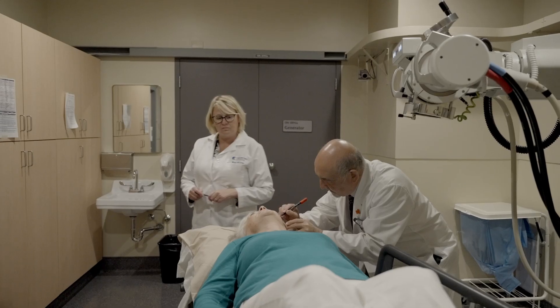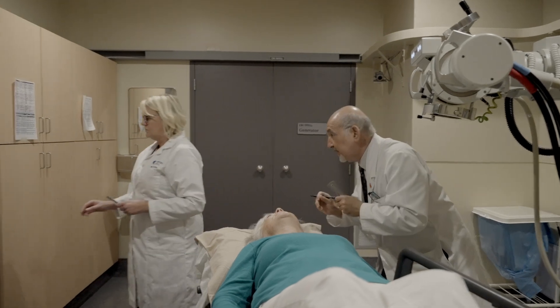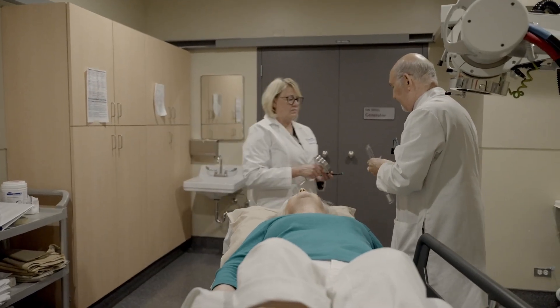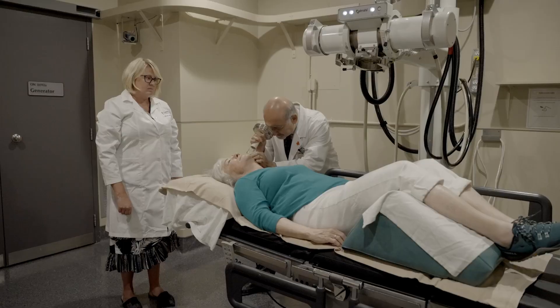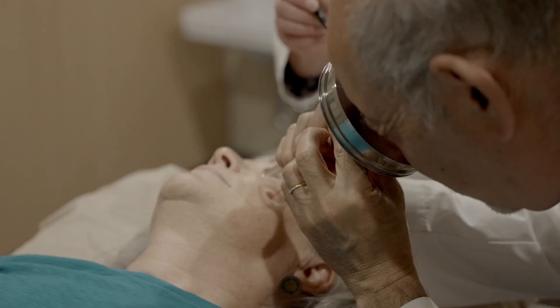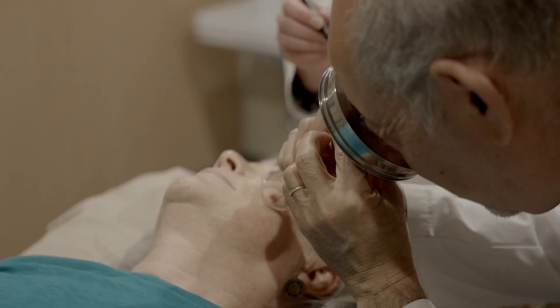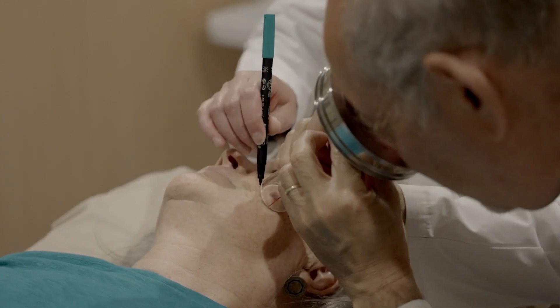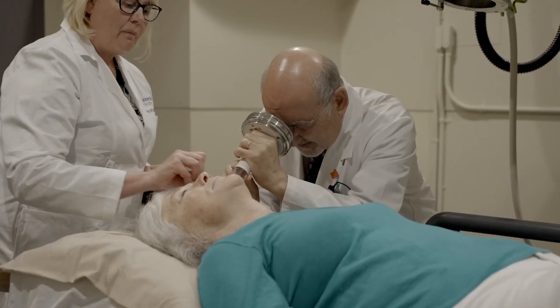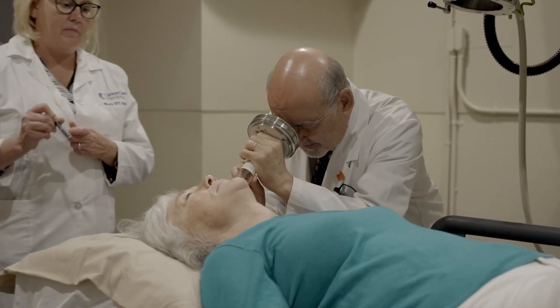Depending on your treatment time, your appointment may be anywhere from 15 to 30 minutes in total. There are some complex treatments that do take longer. During the treatment setup and treatment, you will be asked to lay still. You will not feel anything during the treatment. The treatment machine will have an applicator that may touch your skin, and when the machine is on, you will hear a humming noise.